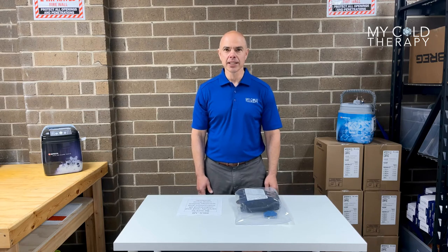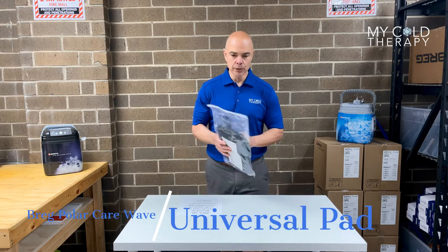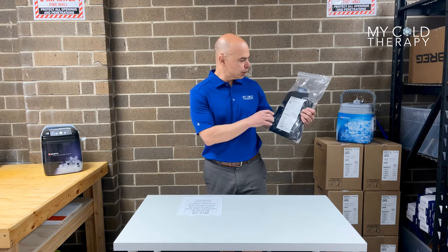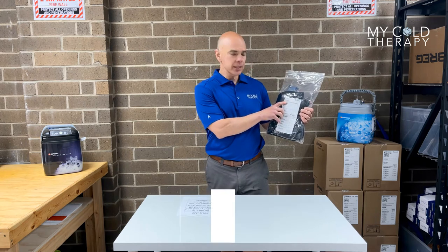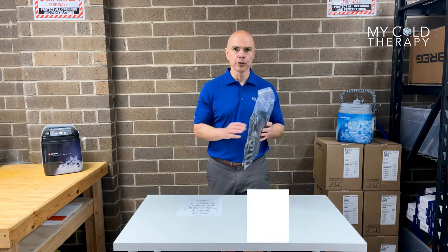Hi, my name is Steve from My Cold Therapy, and today we're going to talk about the Breg Pollicare Wave Pads. This is the universal pad, and this is what it's going to look like when you get it in the mail. First thing you want to do is check the part number. The part number on this is C00016, so that way you know you have the universal pad.